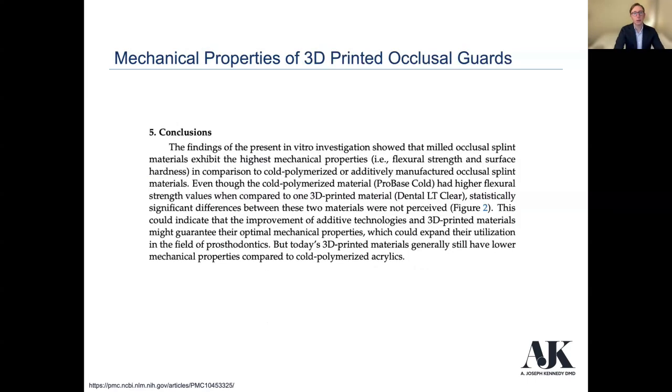So the conclusions here are that this is all in vitro, and that's the one caveat tonight. This research is all fresh, and we haven't really had an opportunity to do some really robust studies, randomized controlled trials, et cetera, with these materials in our patients or out in the real world yet. So I do have to admit that I take a lot of this with a grain of salt. This is all benchtop studies at this point, but still important to be looking at here.